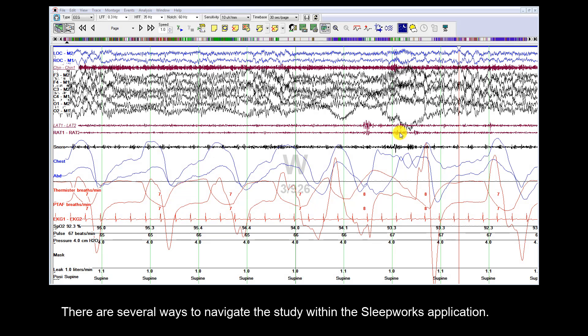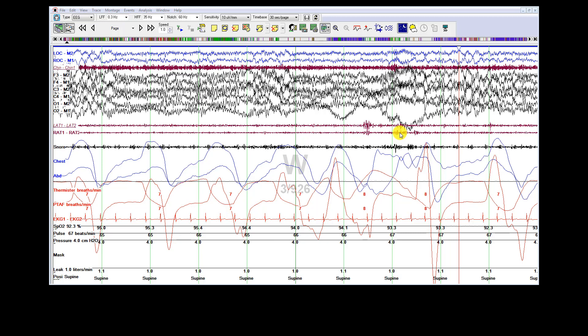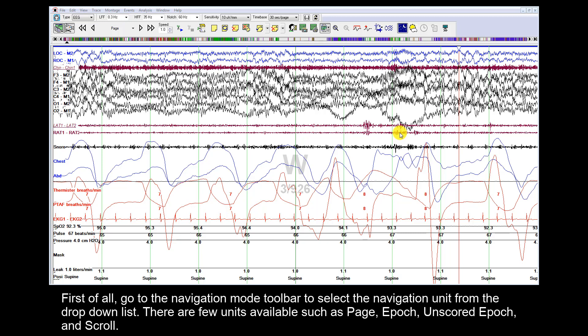There are several ways to navigate the study within the Sleepworks application. First of all, go to the Navigation Mode toolbar to select the navigation unit from the drop-down list.